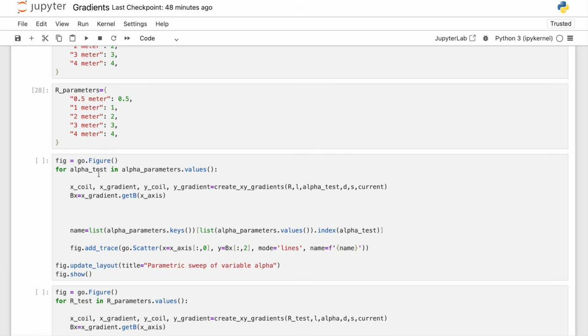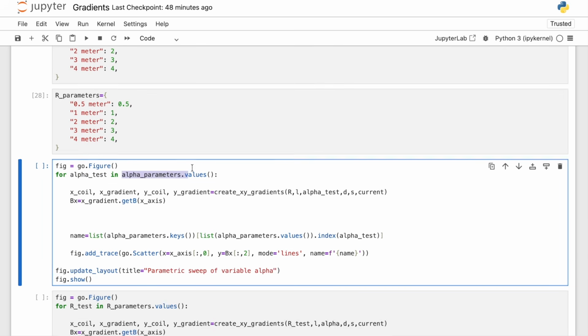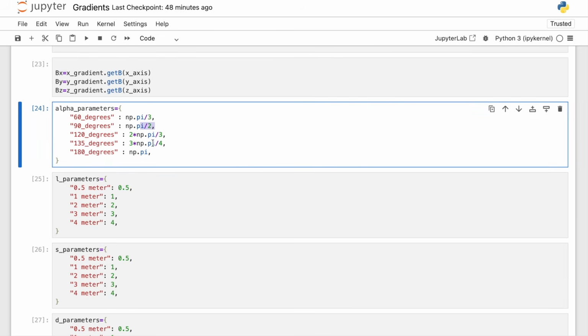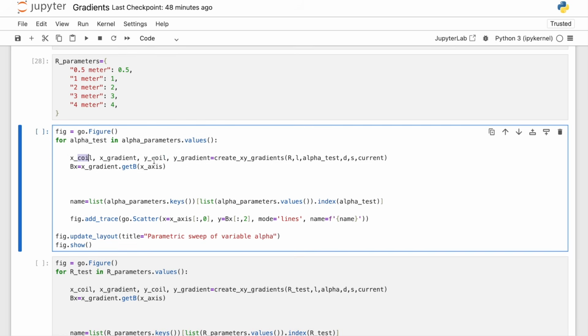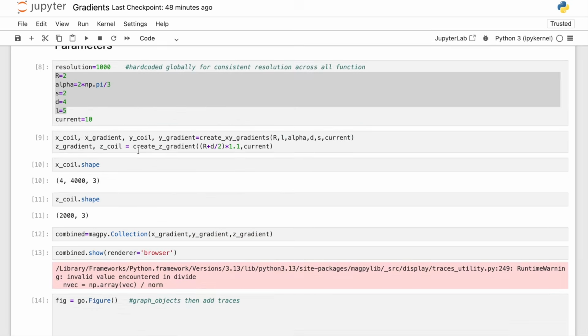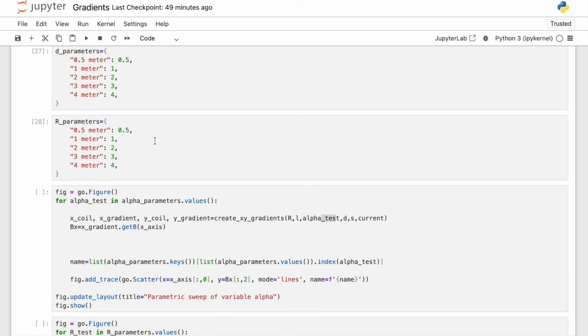So then what I can do is iterate alpha test over my alpha parameters values, which will iterate over pi over 3, pi over 2, 2 pi over 3, 3 pi over 4, and pi. And for each, I will create a new coil, X coil, Y coil, the gradients, using alpha test. This is important to make sure to change, because otherwise if I just put alpha here, it will just use my global alpha defined here. So if I just leave alpha, it will just do 120 degrees, which I don't want to do because I want to do parametric sweep.